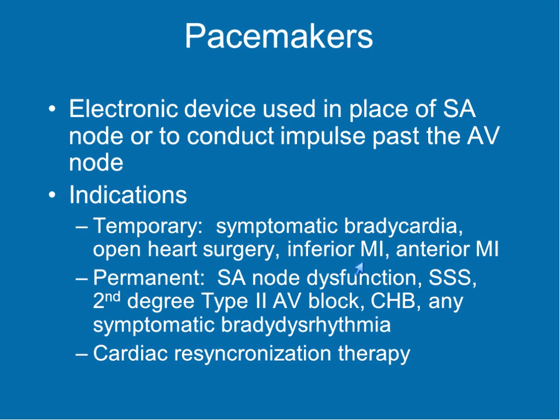It's also not uncommon at all for someone who gets a BiV pacemaker to get an ICD BiV pacemaker all in one. Namely, people who have heart failure often have an ejection fraction of less than 30%, so they're at risk for sudden death. So they need the ICD, and then they can add the BiV pacemaker for cardiac resynchronization and actually improve their heart function. So that's what I'm going to say about cardiac resynchronization.